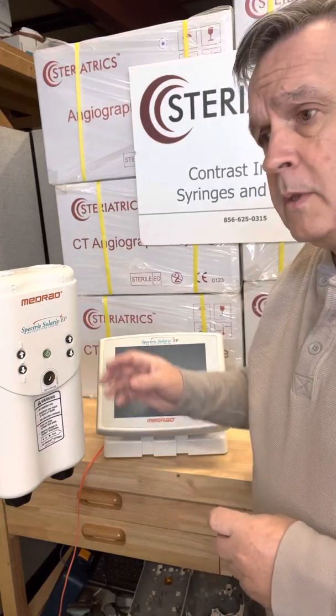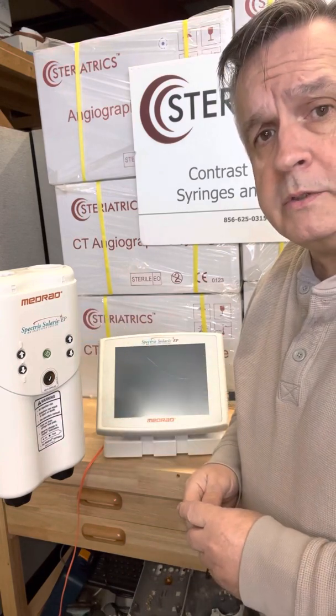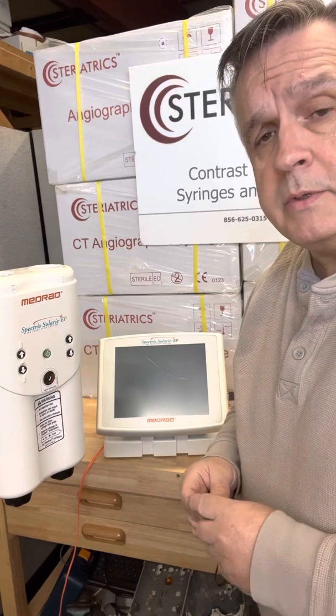Hi, it's Guy the Injector Guy. I'm coming to you with the Medrad Spectra Solaris. It's a quick tutorial on how to use this injector that some of you have been asking me for. So here we go.